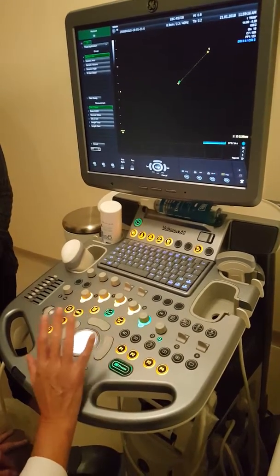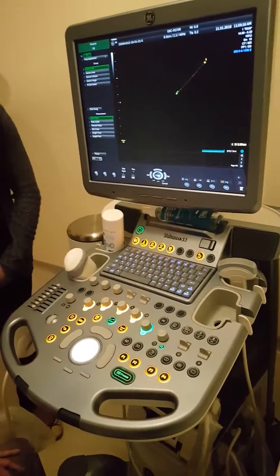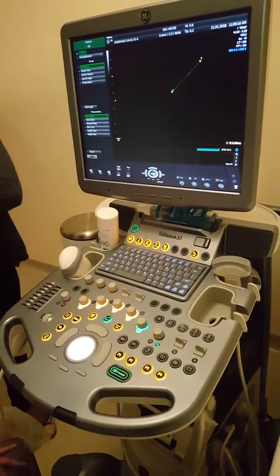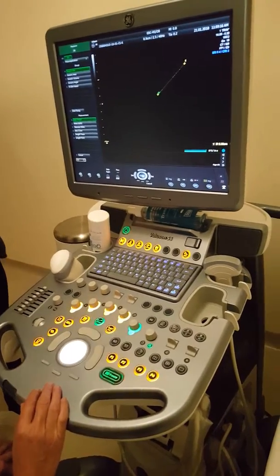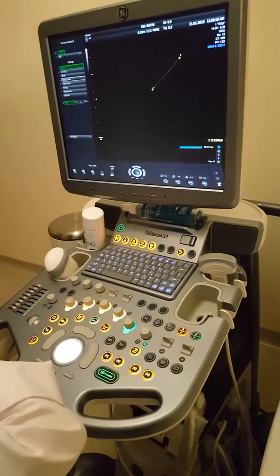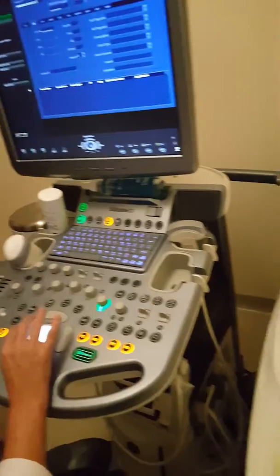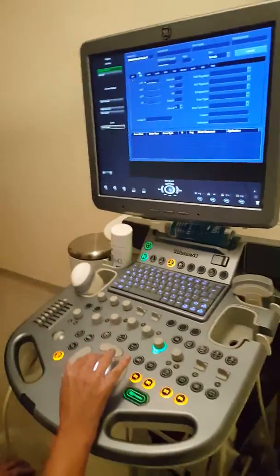So, obstetric, just because I want to see if the head is down and show the heartbeat, or sometimes it's just nice. So then I go to my other probe. So I just enter and whatever. That's always good, it's like taking the plug out. Still OB, I am in OB.